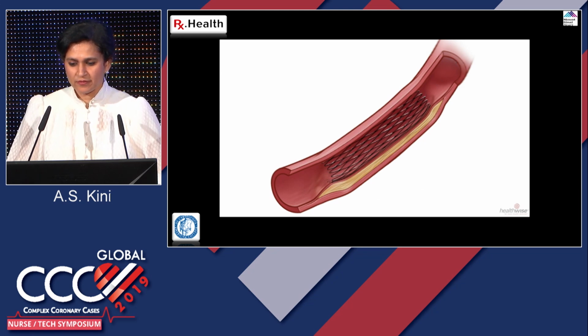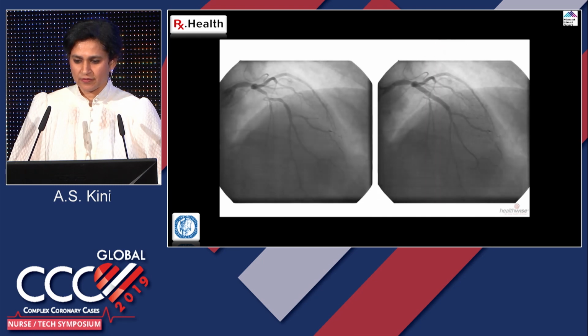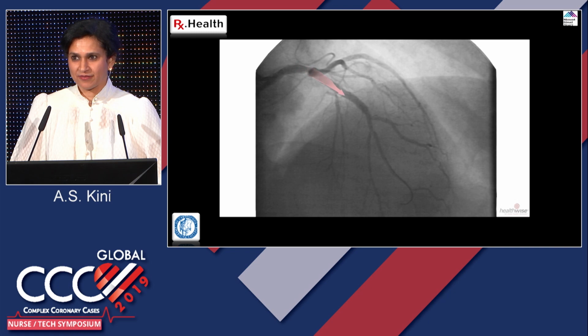After an angioplasty, the narrowed or blocked artery is opened up so blood and oxygen can flow more normally into the heart muscle. These X-rays show a blocked coronary artery before and after an angioplasty. This looks like our pre and post picture. Before angioplasty, the blood flow to the heart is blocked by a narrowed artery. After the angioplasty, blood is flowing better through the newly opened artery.